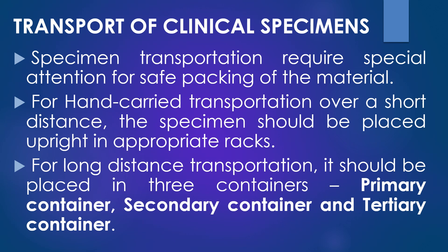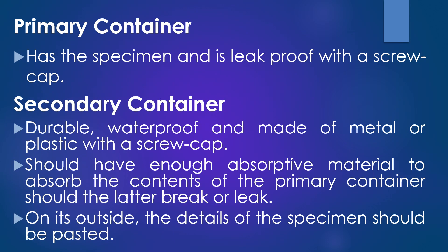The first container is called the primary container, the second is called the secondary container, and the third is called the tertiary container. The primary container holds the specimen and is leak-proof with a screw cap. The secondary container is durable, waterproof, and made of metal or plastic with a screw cap. It should have enough absorptive material to absorb the contents of the primary container should the latter break or leak.